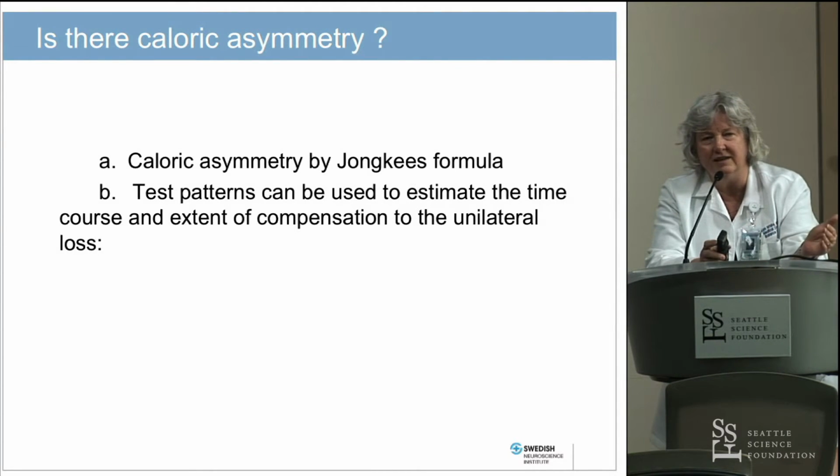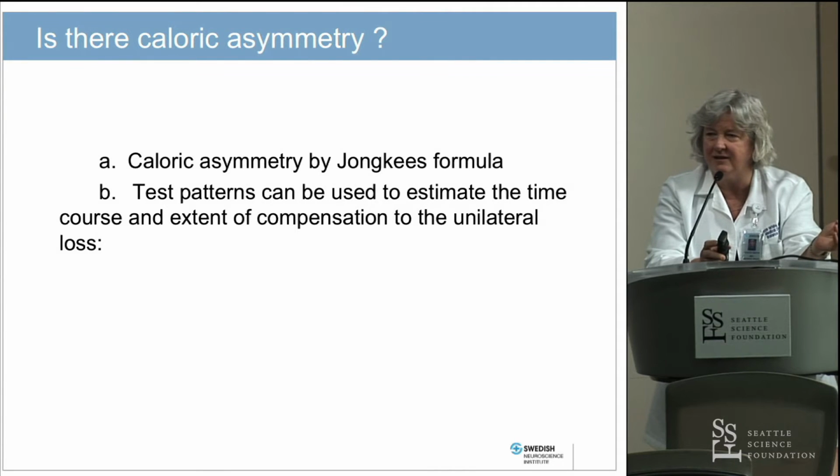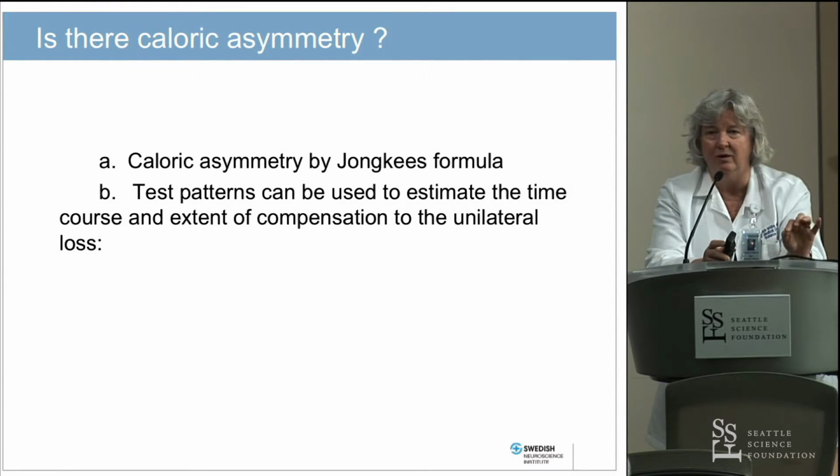You can repeat it on the same person day after day and get different results. And that's the way calorics are. But it's the only test we have that compares left to right and gives you an individual reading on each ear canal. So it has a role, but a very limited role. Don't over-depend on your calorics.